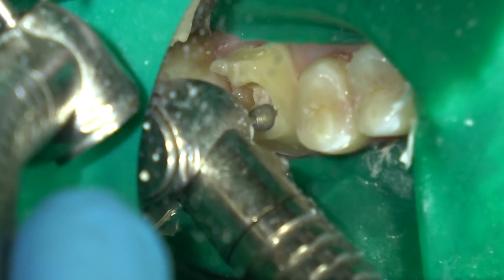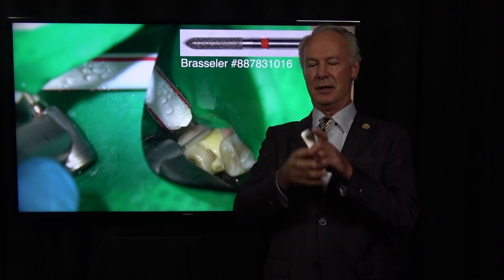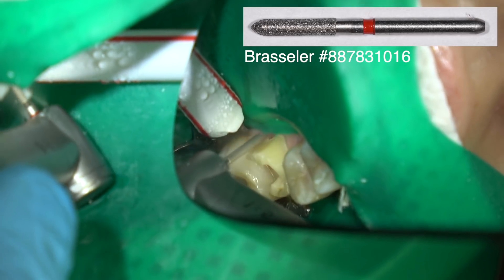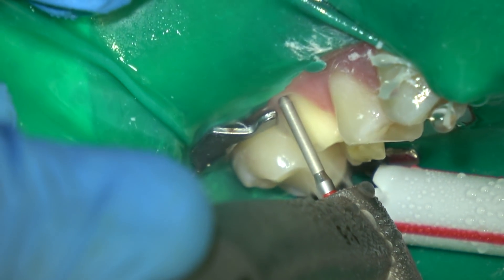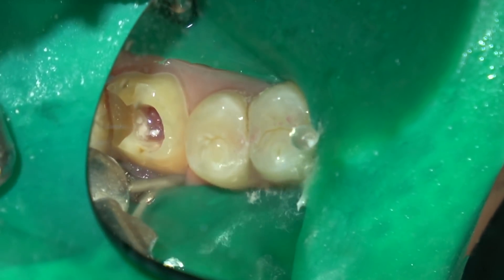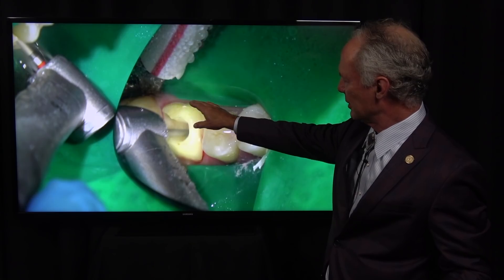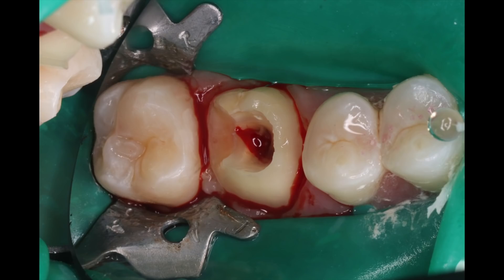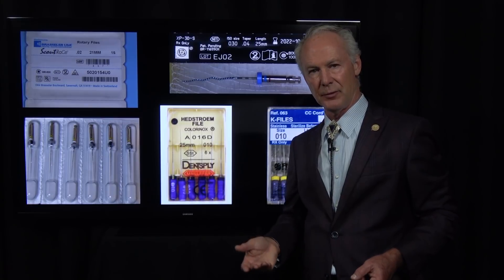You want direct access to the canals — you don't want to go at an angle to get into the canal, you want to go straight in. So open the orifice enough that you can go straight into the canal. I'm using a fine chamfer diamond and a flame-shaped diamond for my final preparatory margins, and then I'm just cleaning out the access opening.